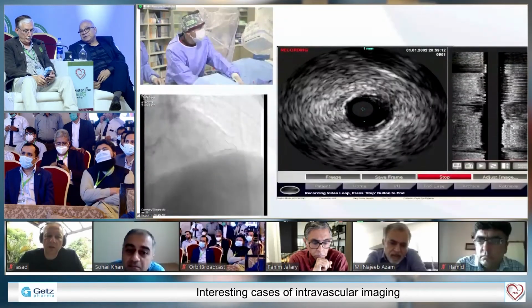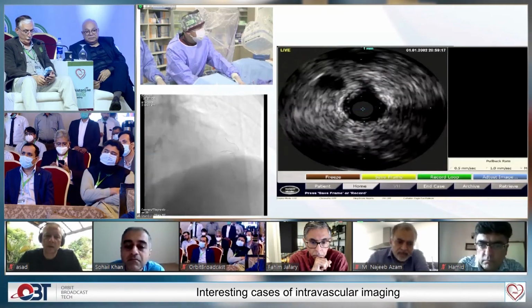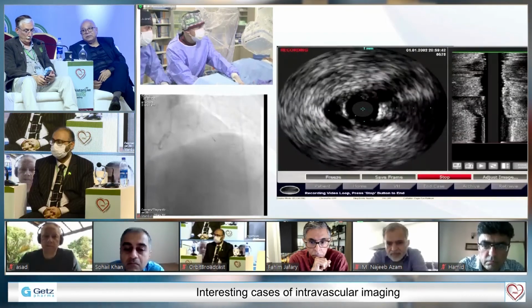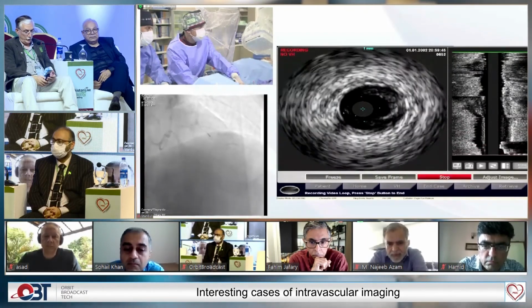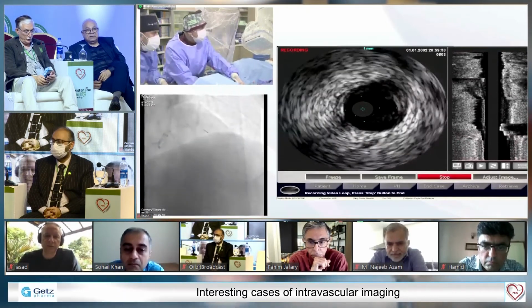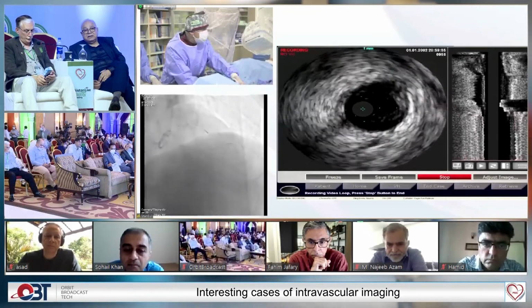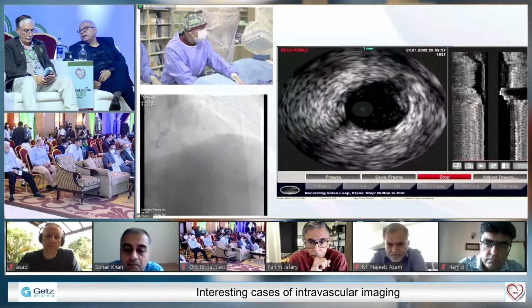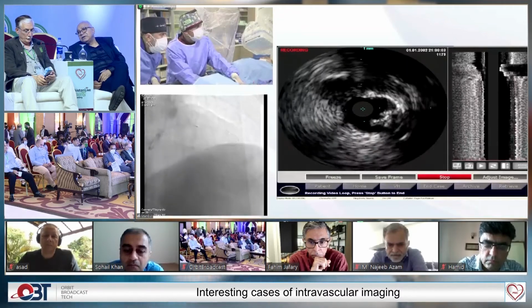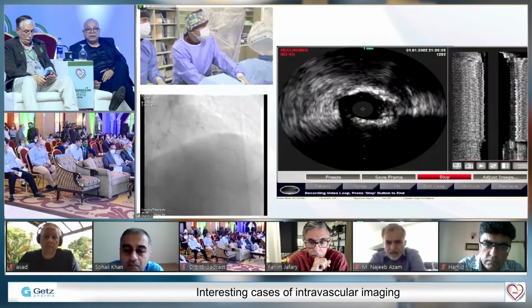I'll pull back. Okay, now I'm pulling back again. Okay, I'm very distal. This looks 3.0 still. In here, still true lumen. We have some hematoma from 4 to 7. We have hematoma, I think because of the antegrade wire. But we are intraluminal here. And here's a very calcified part. And we broke that calcium from 3 o'clock, you see?